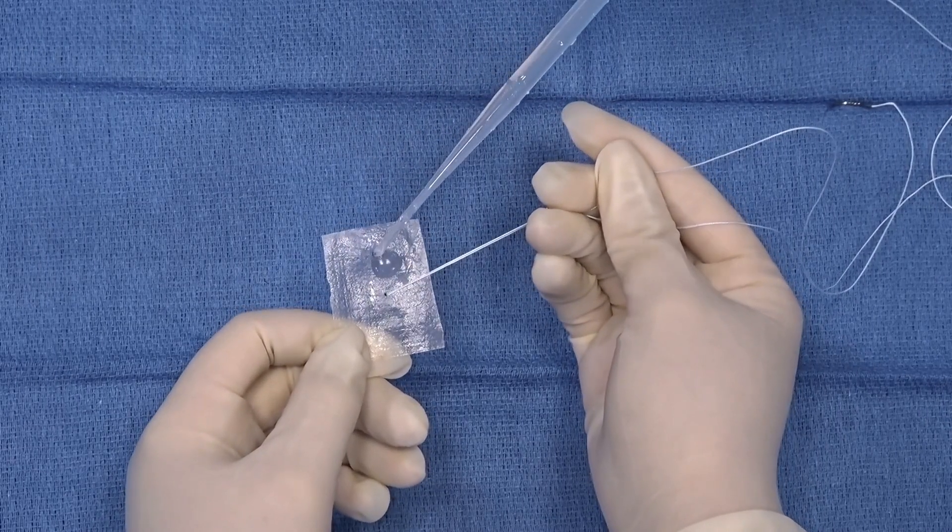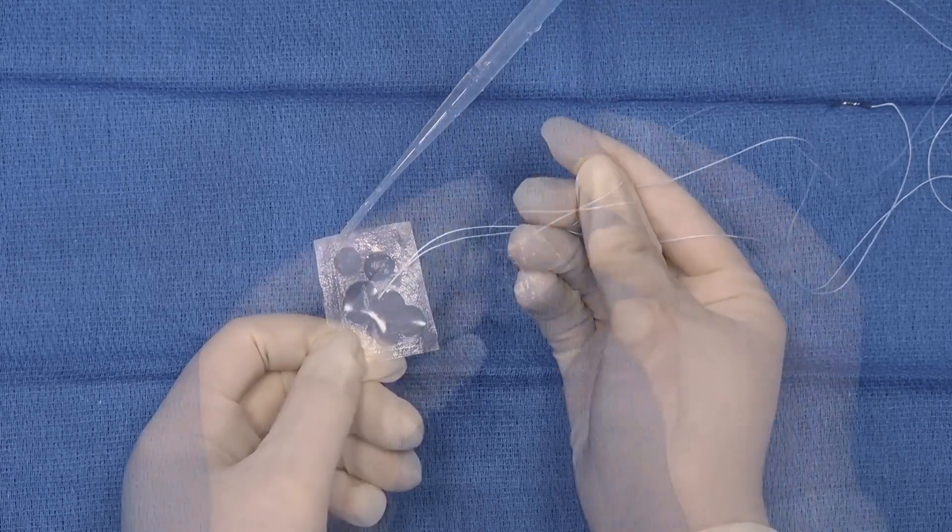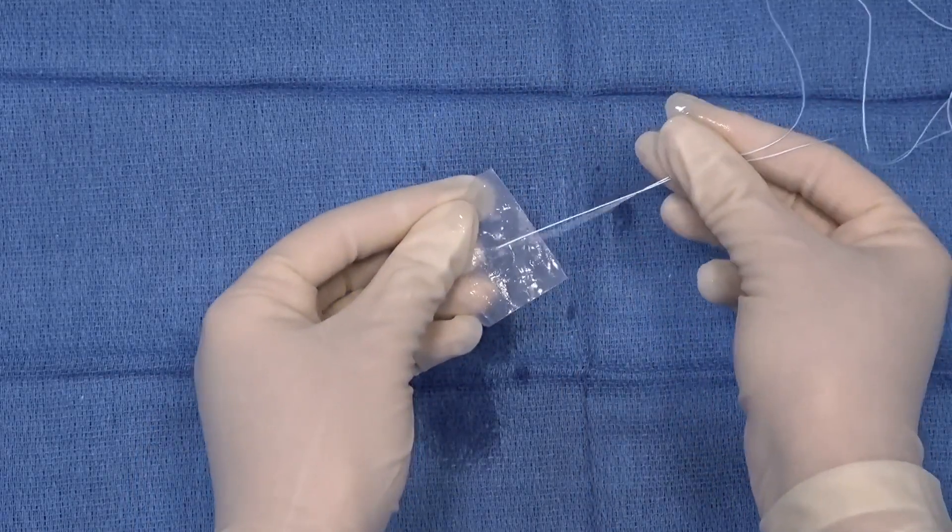Centiflex Placental Matrix can be quickly hydrated with a sterile fluid for maximum flexibility and easy handling, and it is terminally sterile.